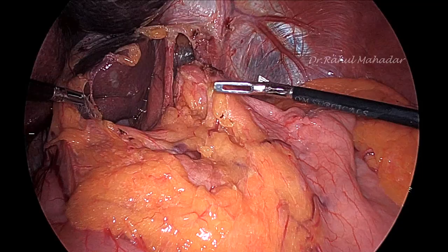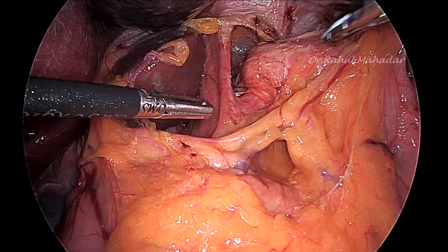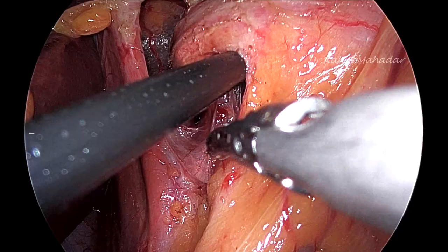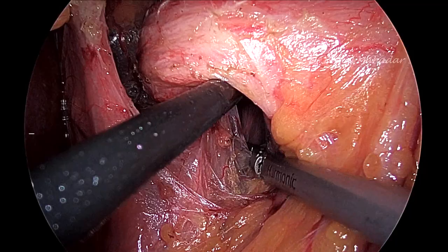Now you ask the assistant to catch hold of the OG junction specifically and lift it up so that you will see the posterior vagus now and the esophagus, and below that you can make a posterior window. With the help of a left hand instrument, you push the structures and dissect them, and you will be making a window posteriorly. The rest of the dissection is carried out with the help of a harmonic scalpel.